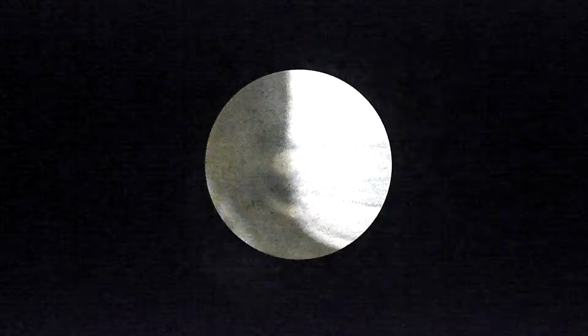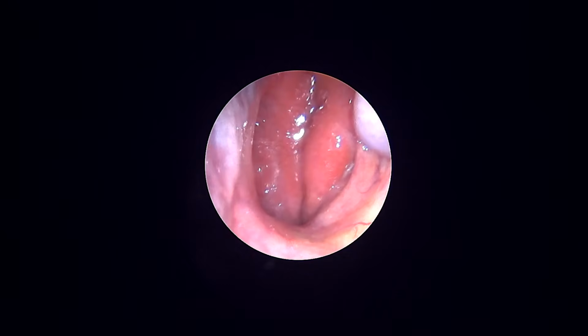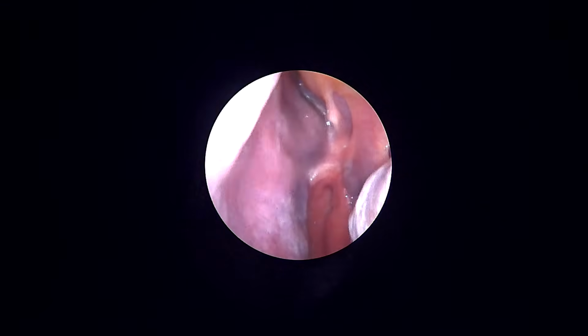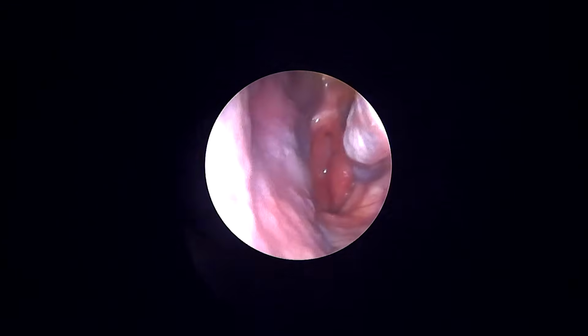It will be very important to see the follow-up. So the patient came to me after 6 months, when we did the nasal endoscopy. So this is the picture. You can see a well healed inferior turbinate. Nasal patency is very well maintained. No evidence of any mass, any tumor.